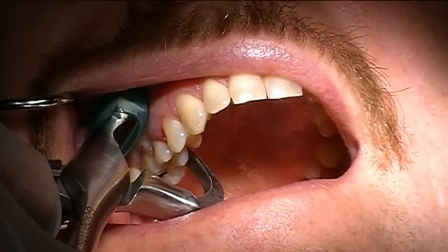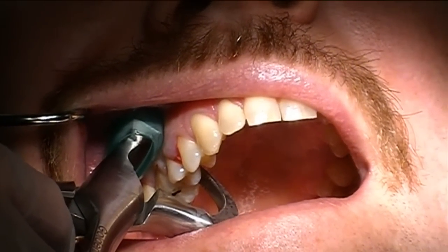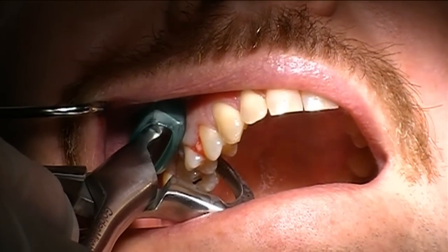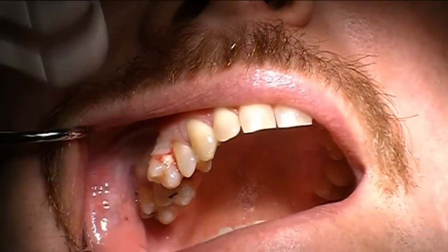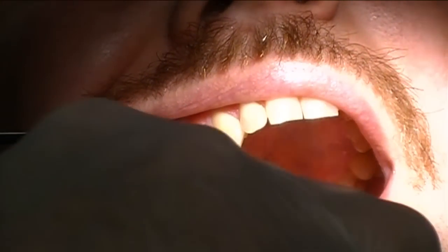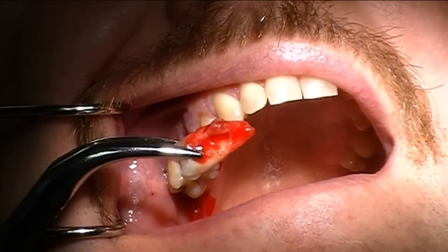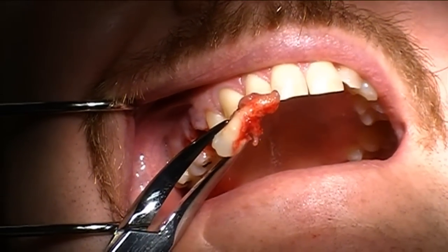Now what I'm doing is holding the forcep rather lightly and rotating my wrist. There's no arm pressure. It's a simple rotation of the wrist. Slowly, and you saw that little pop. And I'm just going to take another forcep and simply remove the tooth and the infection. Go ahead, if you can rinse the section. And you can see the infection, you can see the fracture, and we got the root out in one piece.